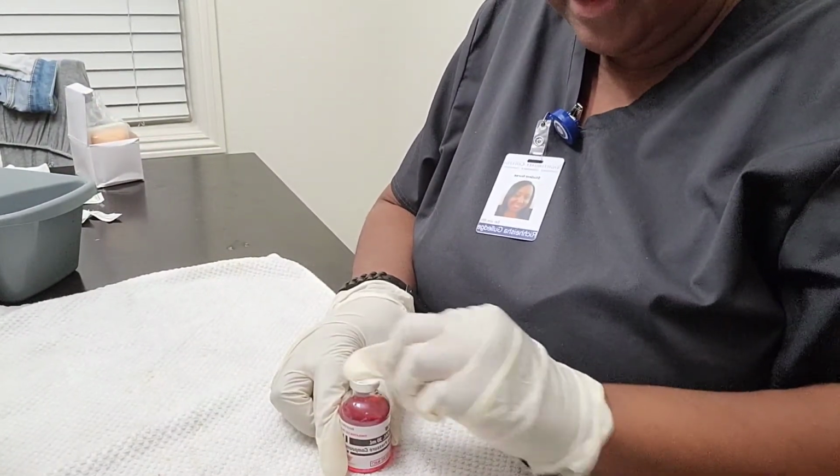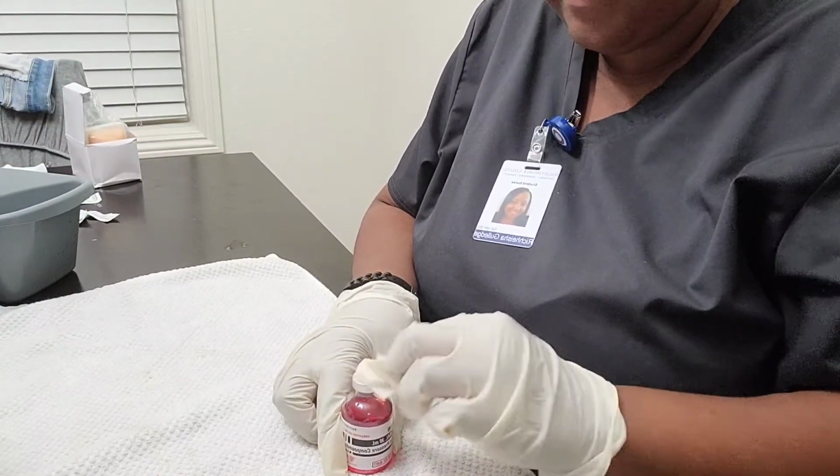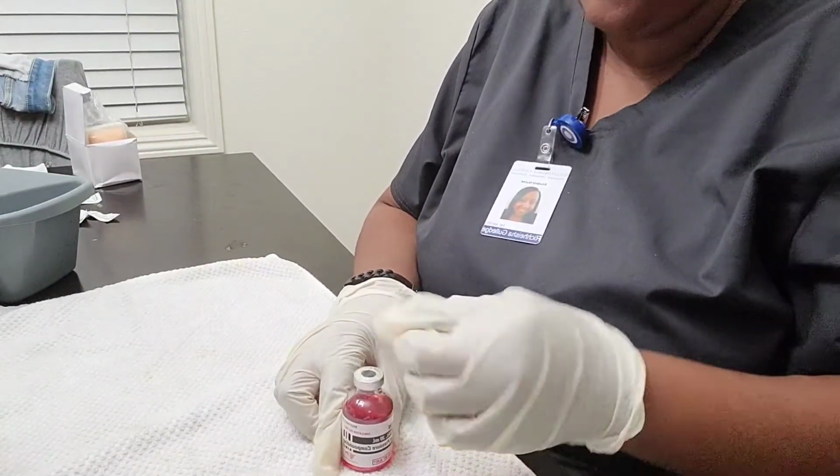I'm going to take that and wipe the top off the alcohol pad. Okay.